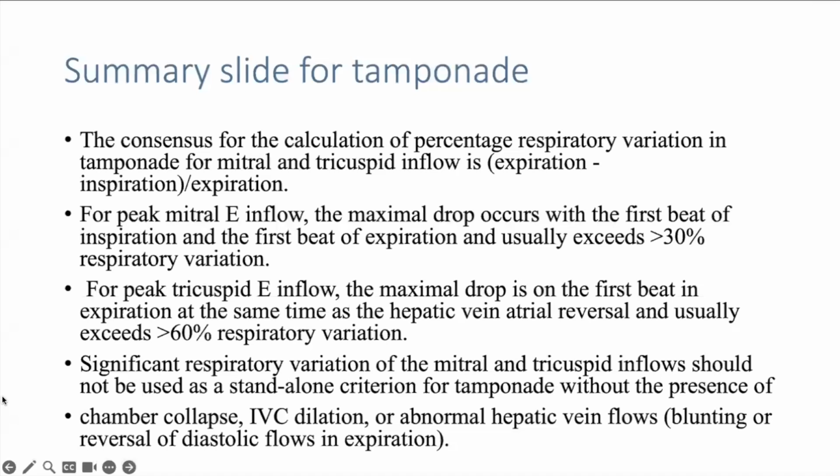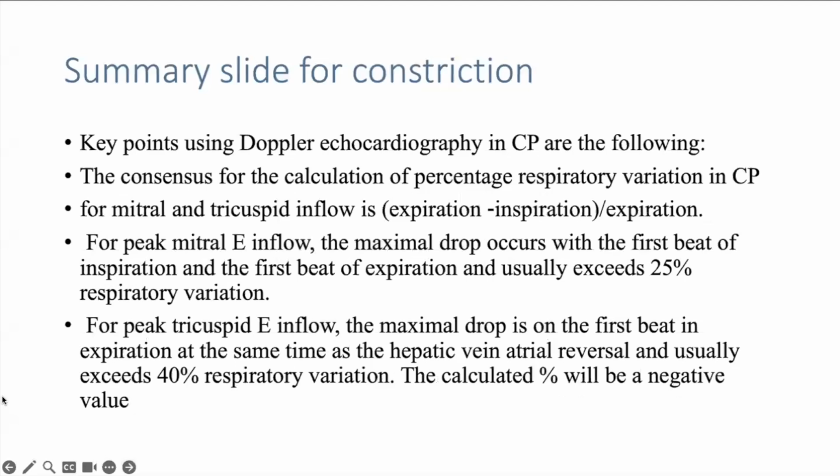This is a very rich slide, but it's a summary of what you find in tamponade in terms of tissue Dopplers and velocities. And this is another slide for constriction.